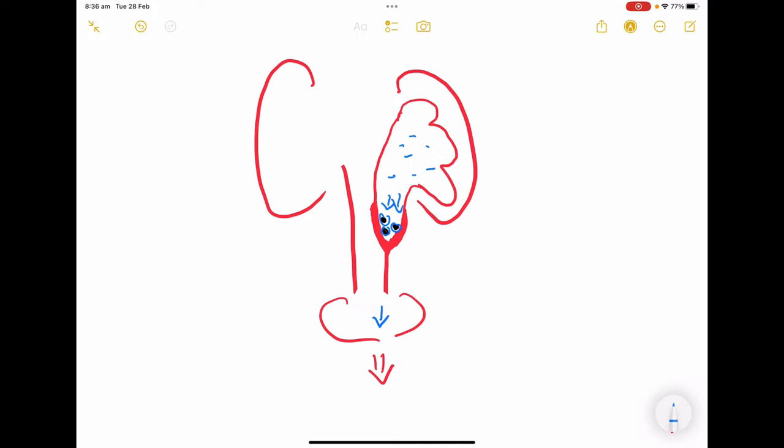At the end of this surgery, as you can see, there is this part of the ureter here that's a bit redder, and what I'm trying to show you is the inflammation and the swelling that occurs as a result of the surgery itself. This swelling, as with any swelling that occurs in a narrow place, can cause the ureter to be blocked up again even though the stone has been removed. What happens is urine then needs to be recollected again, it causes more pain again, and even after the surgery is done, you can still experience a significant amount of pain. The good thing is the swelling usually disappears after 3 to 4 days of rest.